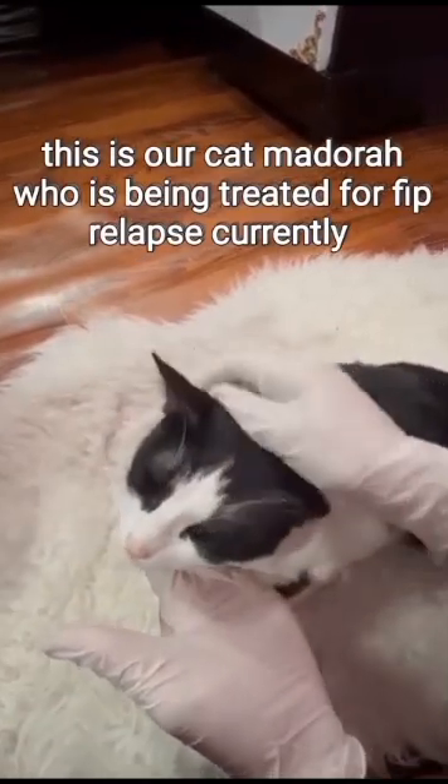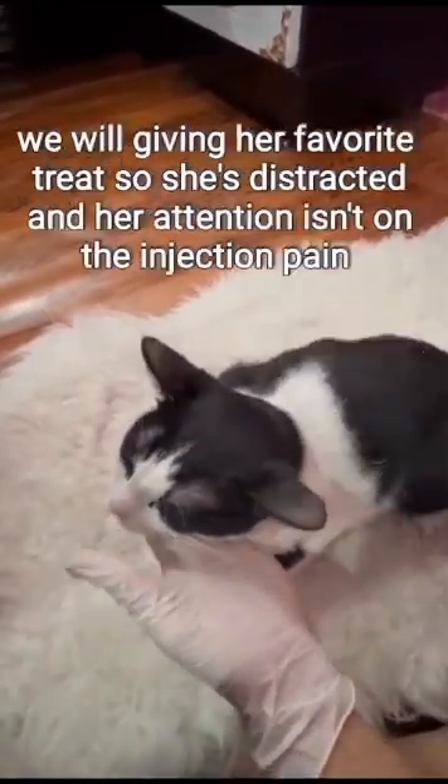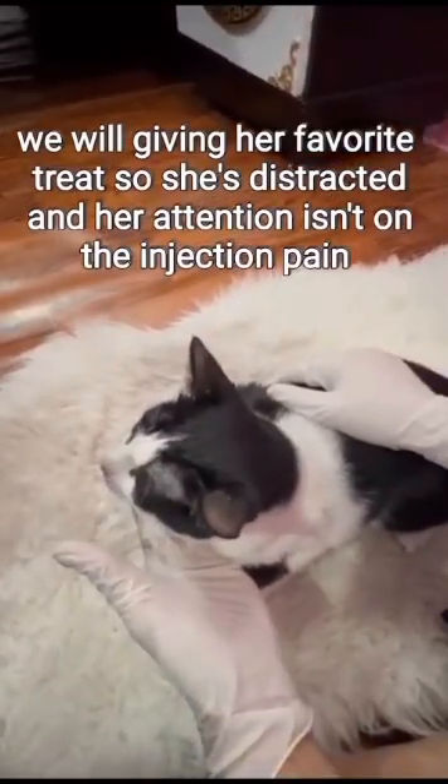This is our cat Madora, who is being treated for FIP relapse currently. We will be giving her a favorite treat so she is distracted and her attention isn't on the injection pain.